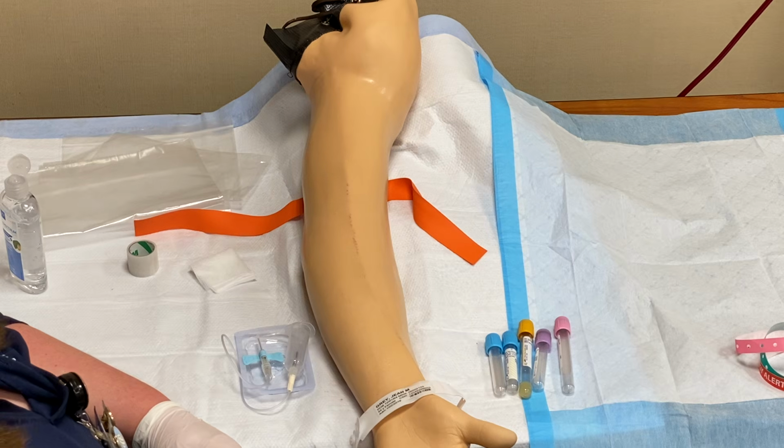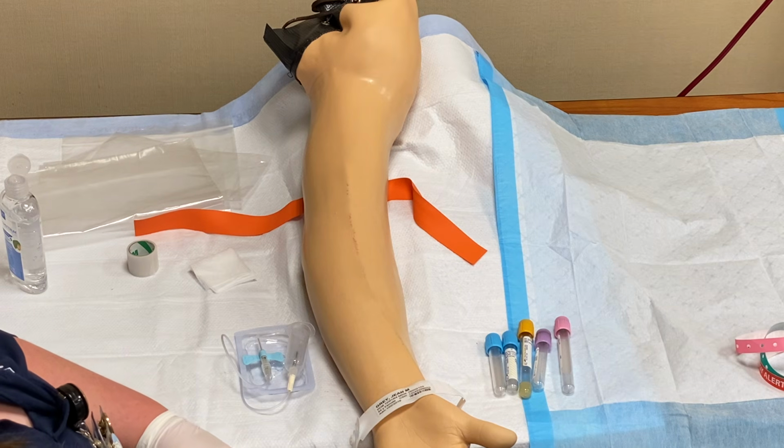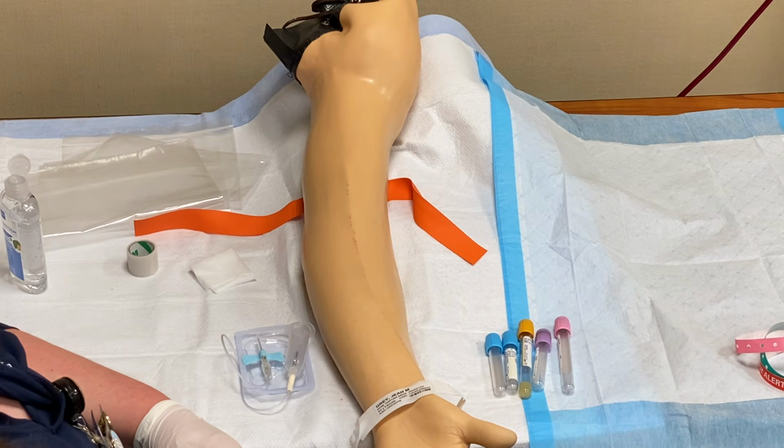And I wanna make sure that I don't fan on the arm. I don't blow the arm to get the alcohol to dry. I don't pat it dry. She's keeping her arm still because I don't want anything to get the site dirty after I've cleaned it.